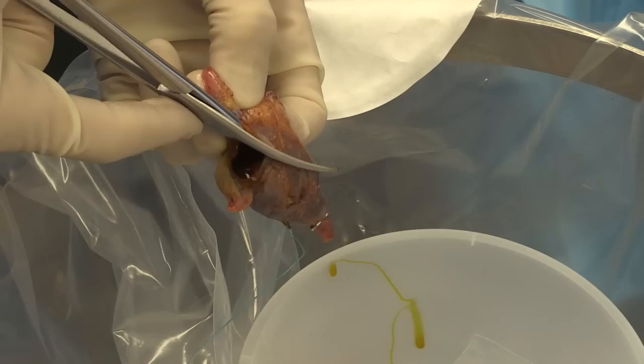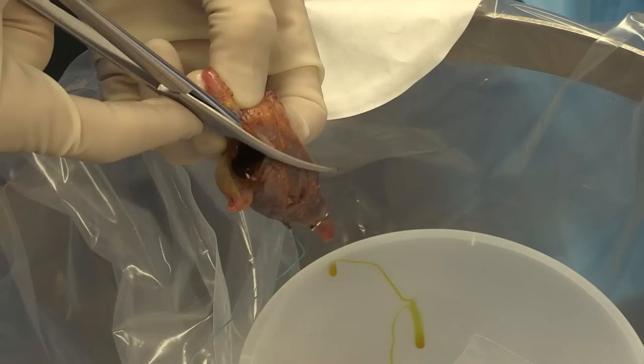The gallbladder is opened off of the surgical field, and you can see in this case that there was a single pigment-type stone in the gallbladder. Thank you very much for watching this video, and I'd be happy to answer any questions.